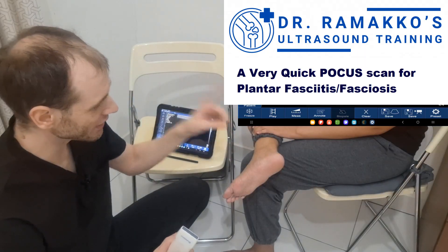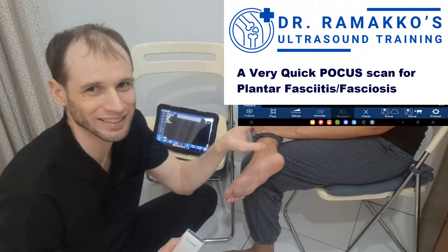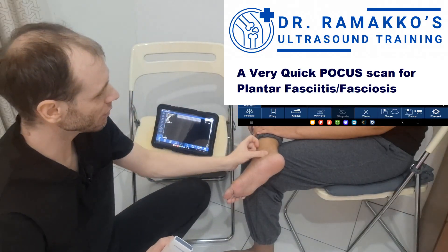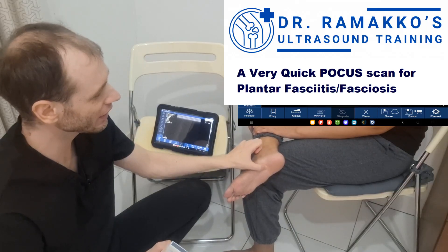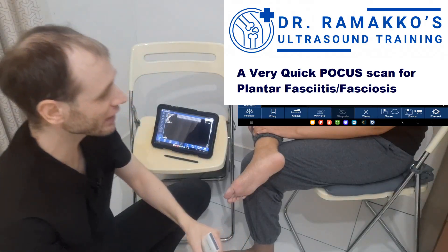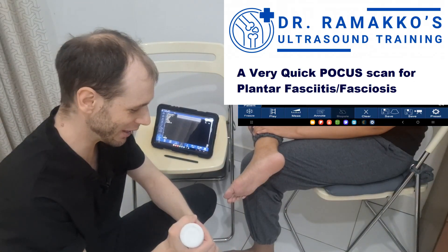I've already scanned her before, and in particular she has probably the most difficult plantar fascia I've ever had to scan. It's very thin, and the medial tubercle you'd expect around here, but it's actually a little bit further on her. So if I can evaluate her plantar fascia, I can probably evaluate anyone's.